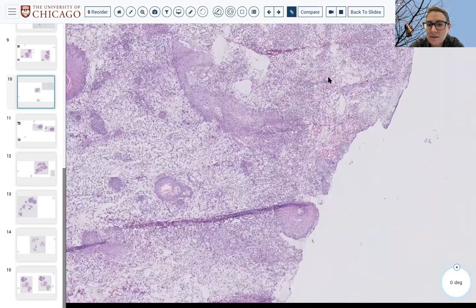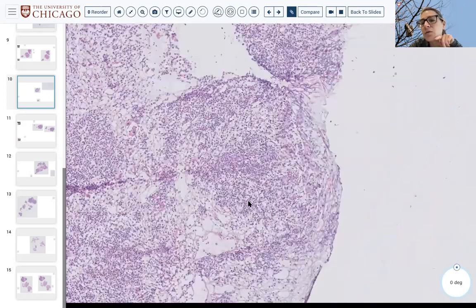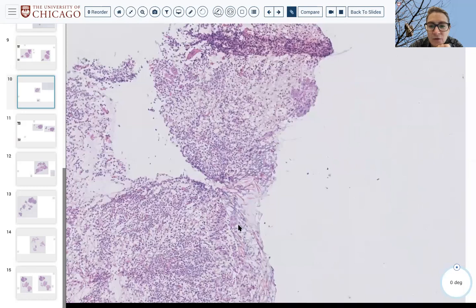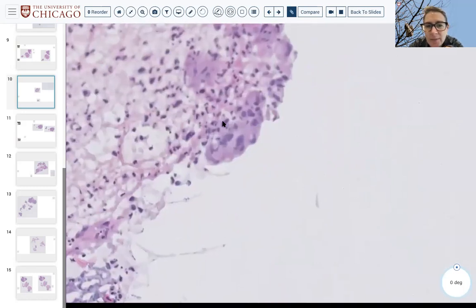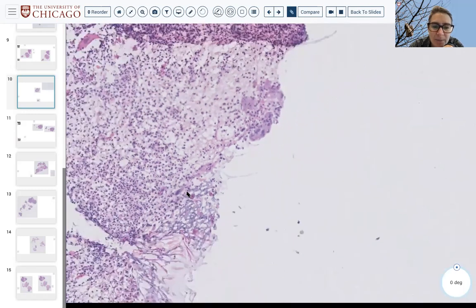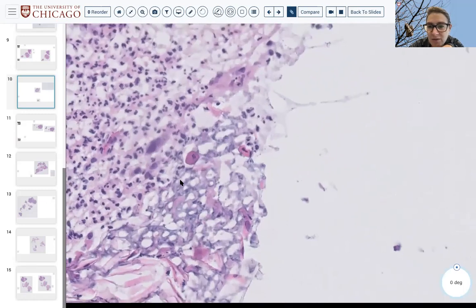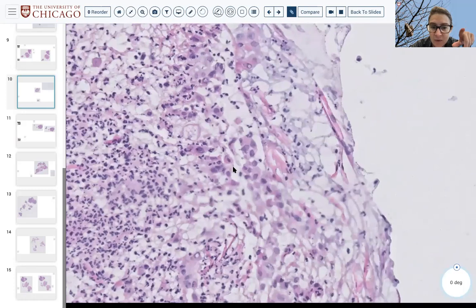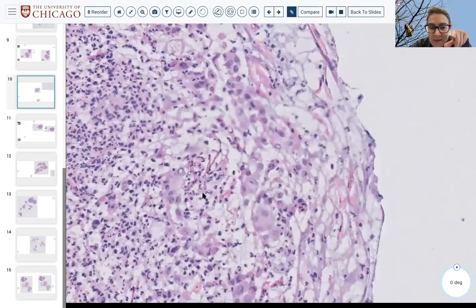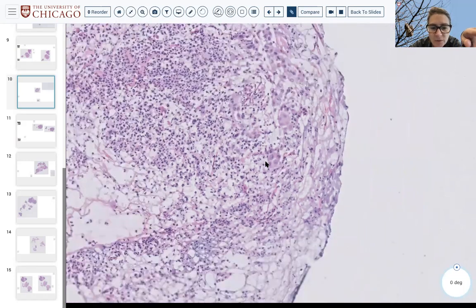But yes, this is gingival mucosal carcinoma coming from inside, eroding out into the skin, and therefore the islands of carcinoma that you're seeing are, that's a little blurry, sorry about that, very deeply keratinizing little tadpoles with giant wrinkly nuclei. Since this is a keratinizing carcinoma, you still have cytoplasmic keratin, you still see the cytoplasm, but this is too atypical for nothing.